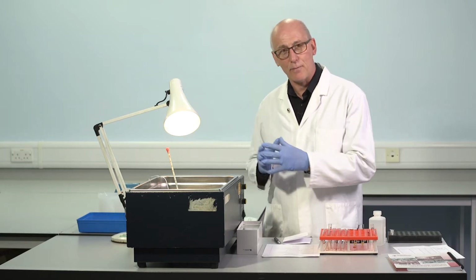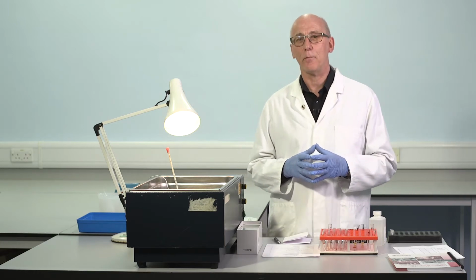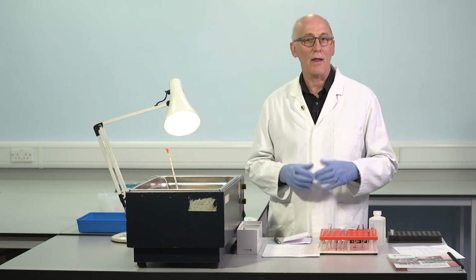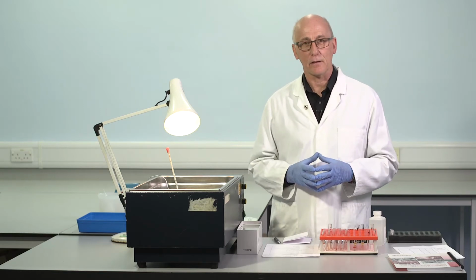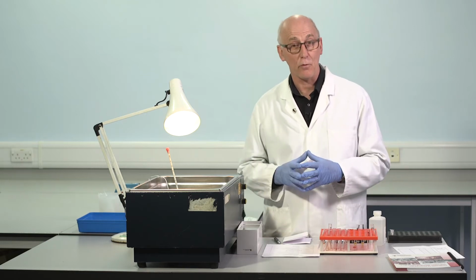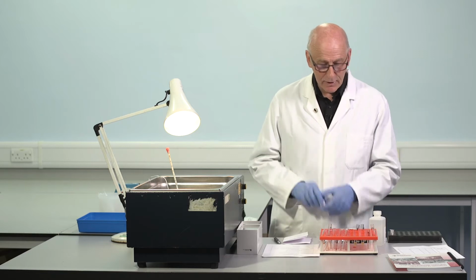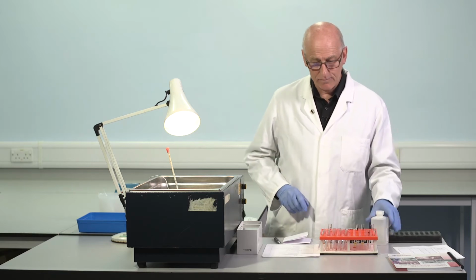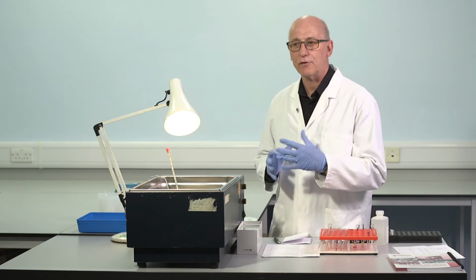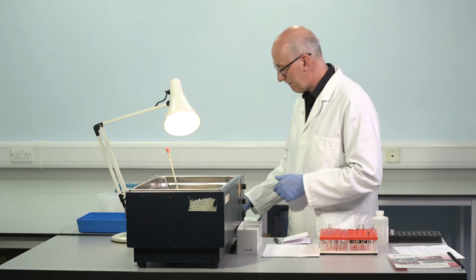I think the method we're about to show is acceptably precise. It's perfectly usable for patient management purposes. And that's an advantage in a centre that's not able to put in place a complex autoanalyzer. So that's the other reason why we're also going to work in the water bath today. So we have the calibration plasma and some diluent. We'll be making 3 different dilutions, and then we'll generate some clotting times, and we'll discuss what we're doing as we go along.